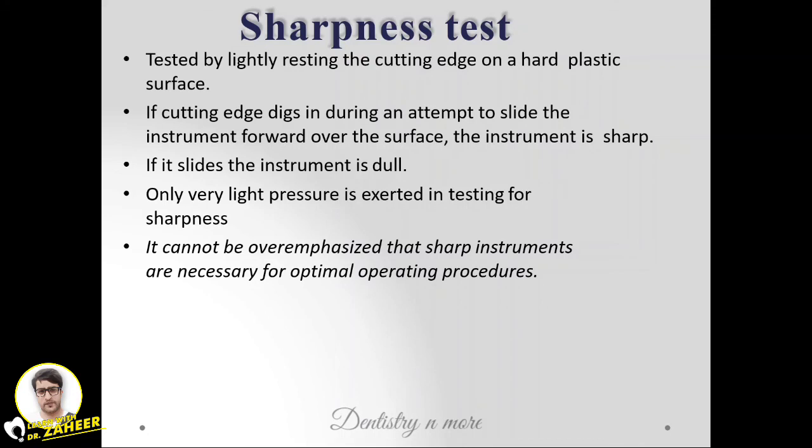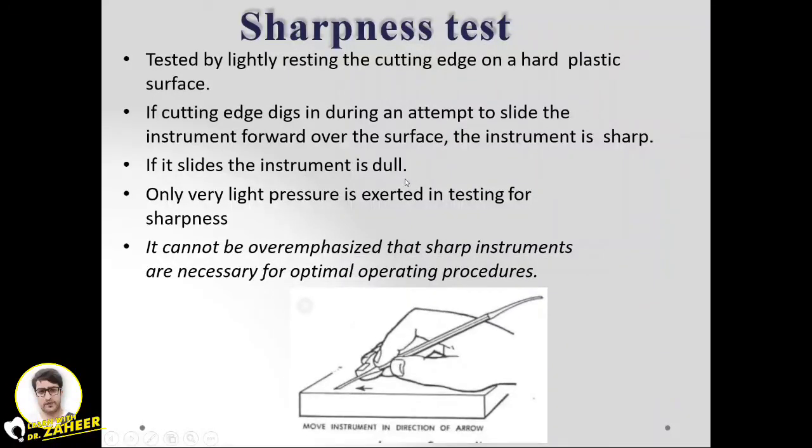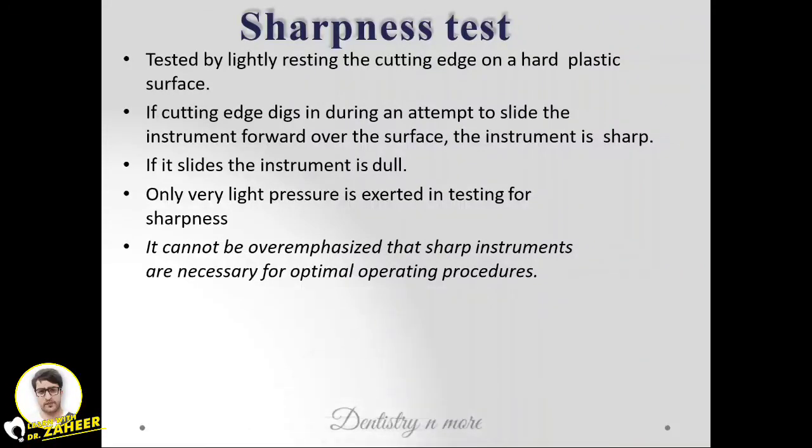So we have a test to check the efficiency of a newly sharpened instrument, that is by lightly resting the cutting edge on a hard plastic surface. If the cutting edge digs in during an attempt to slide the instrument forward over the surface, the instrument is sharp. If it slides, it is not sharp, it is still dull, and needs to be redone. Only very light pressure is exerted in testing for sharpness. It cannot be overemphasized that sharp instruments are necessary for optimal operating procedures.